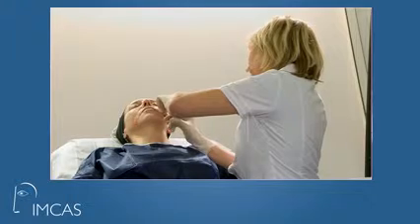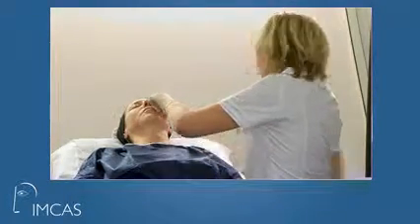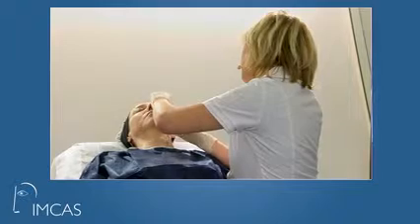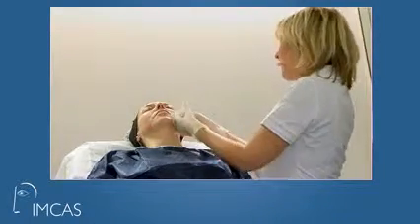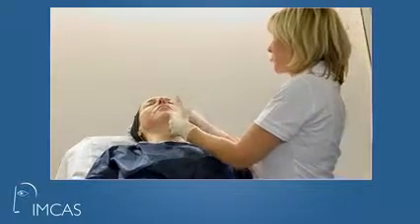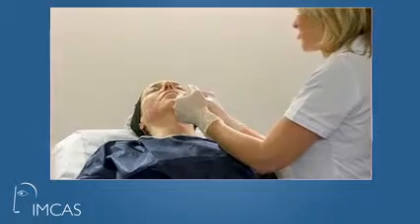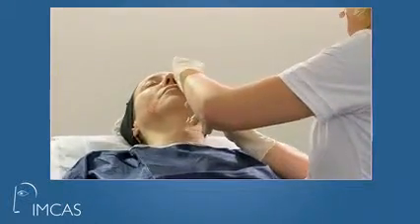I don't know if you can see because I have my hand just before. I will continue with ultra deep, okay? And I am injecting the cheekbone, the tip of the cheekbone. You can see? Okay. I would like to ask something to Jonathan.